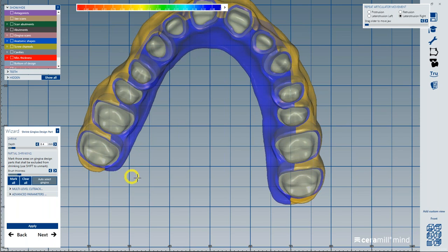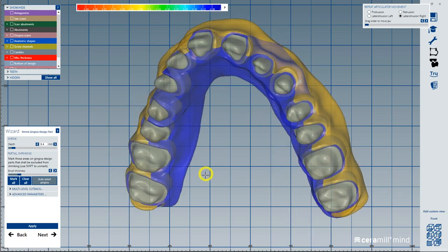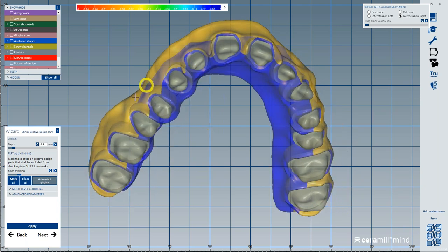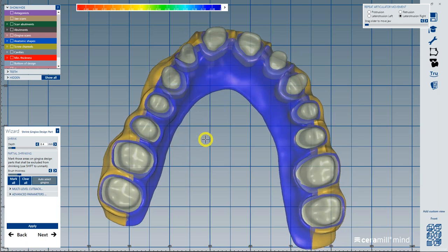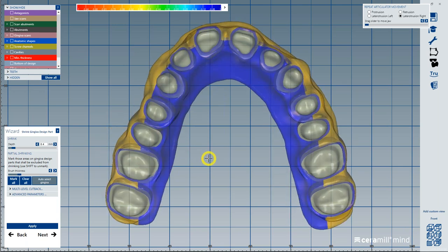Shrinking of the gingiva depends on how you finish this restoration. I'll show you some of the options here. If you're going to do this in full zirconia, you may reduce this more because you need more room for your porcelain material to go over it, your pink porcelain, your gingival porcelain. If you're doing this in PEEK or some other hybrid materials, maybe you don't reduce as much. It just depends. That's one of the artistic sides of creating these.